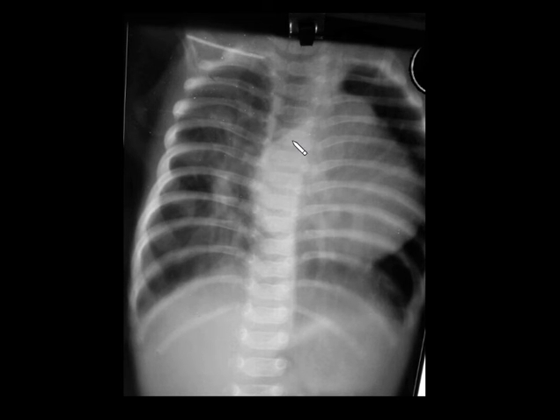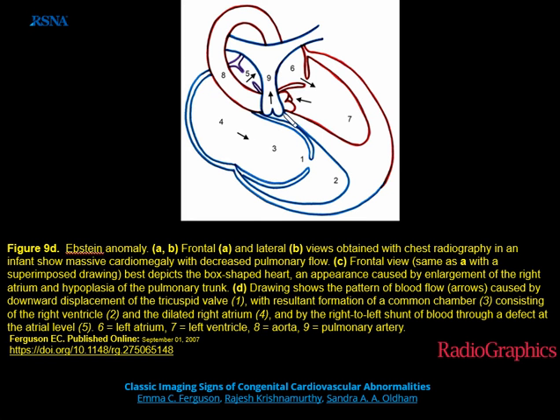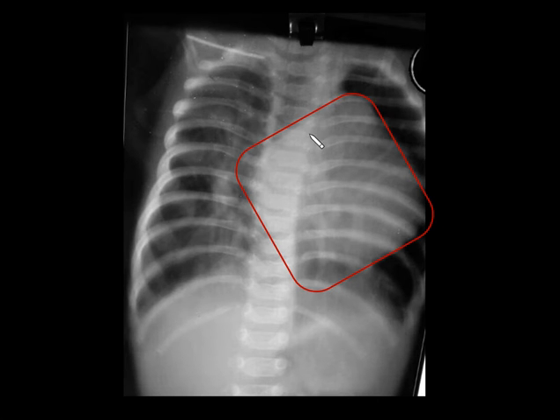Coming to the next case, you can see the box-shaped heart seen in Ebstein's anomaly — congenital tricuspid regurgitation causing enlargement of the right atrium and hypoplasia of the pulmonary trunk. There is downward displacement of the tricuspid valve causing atrialization of the ventricle. The dilated right atrium with tricuspid regurgitation and right ventricular enlargement gives this classical box-shaped heart. Remember box-shaped heart in Ebstein's anomaly.